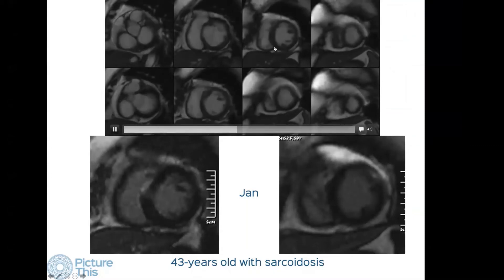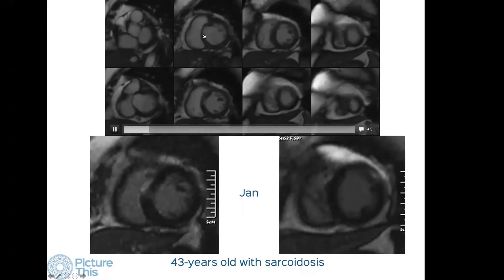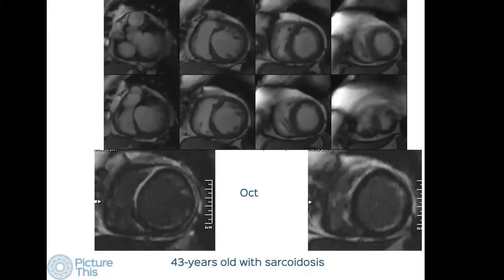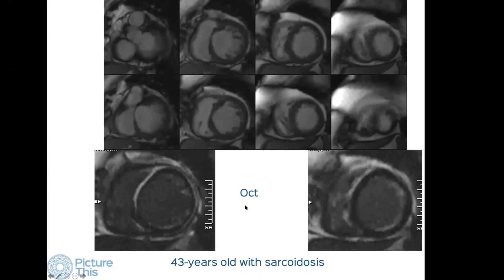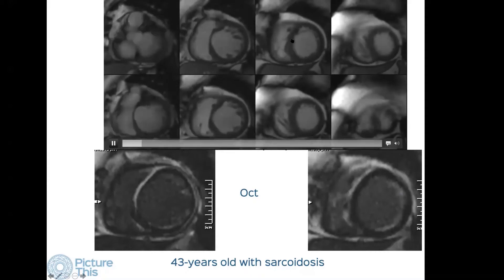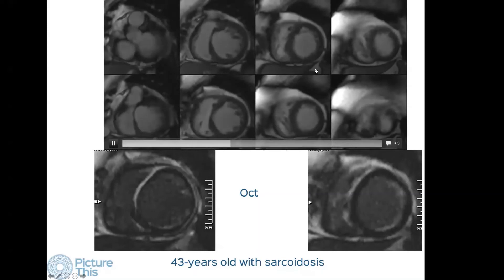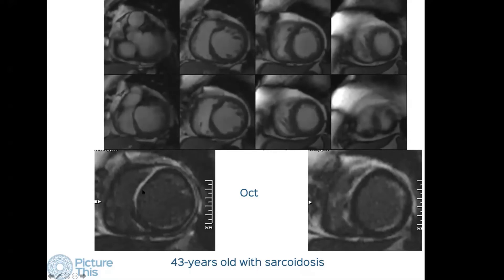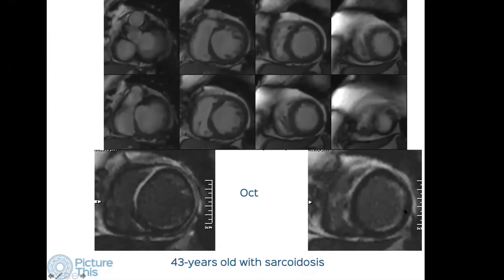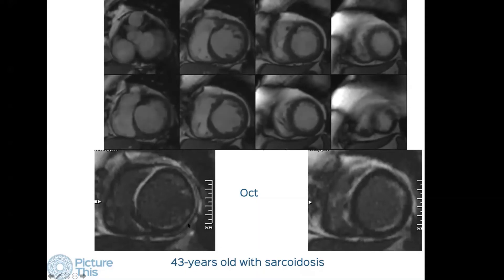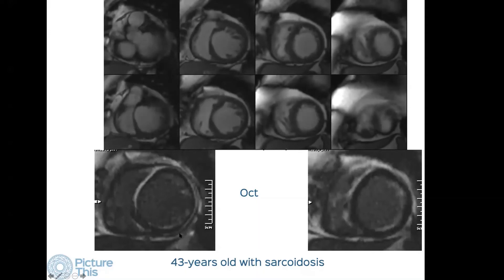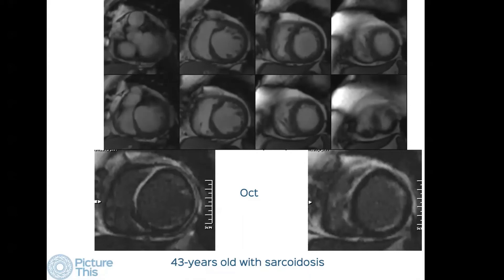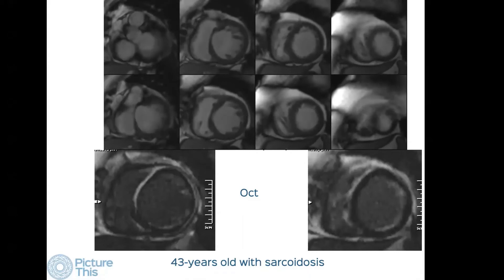Here is a 43-year-old man with sarcoidosis — depressed overall systolic function, marked thinning of the basal anteroseptal segment with a focus of fibrosis. We use cardiac MR to follow up these patients. In October this patient deteriorated: the LV is larger, there is increased hypokinesia and akinesia, fibrosis has markedly increased in the anteroseptal segment, and we now also see subendocardial fibrosis along the lateral and inferior walls with some epicardial fibrosis. This patient is clearly progressing and would probably require an AICD to prevent sudden cardiac death.